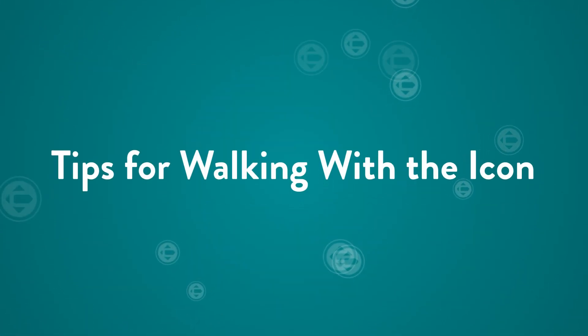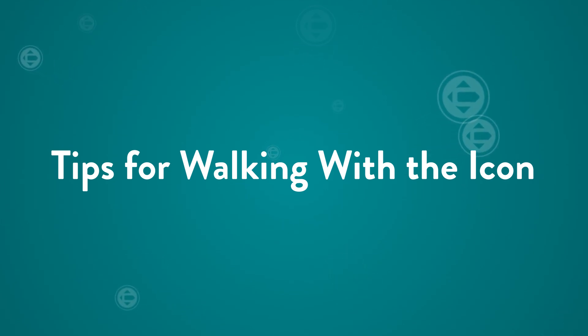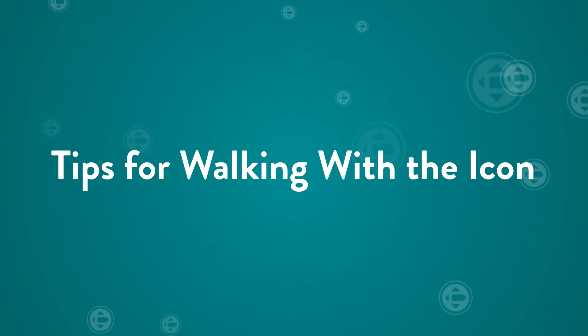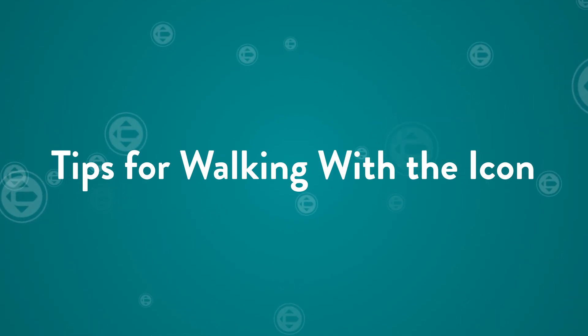Here are some best practices for walking with the ICON knee. Oftentimes, when the user initiates swing too easily or has trouble releasing into swing, it is because one of the swing initiation parameters have not been met.